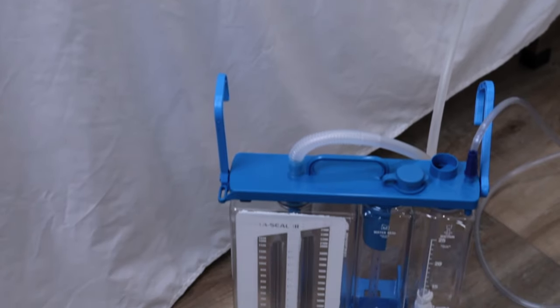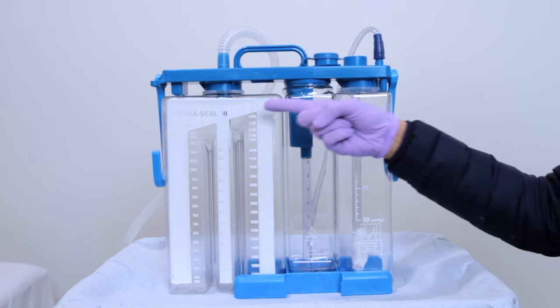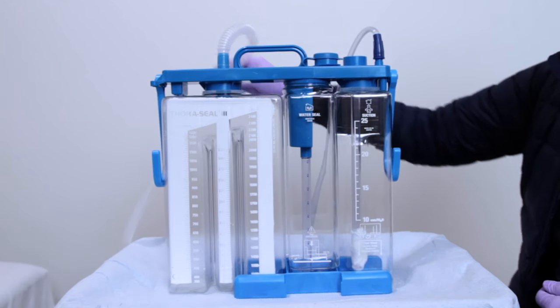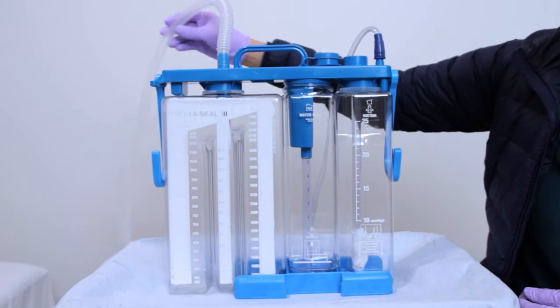Now let's dive into the parts of a thoracic chamber chest tube. Check all connections to ensure the system is airtight. Be sure to keep the chest tube position below the level of the patient's chest. There are three components: your suction setup, your water seal chamber, and your collection drainage unit. This is the tube that connects to the patient and should have a dressing applied per your hospital guidelines.